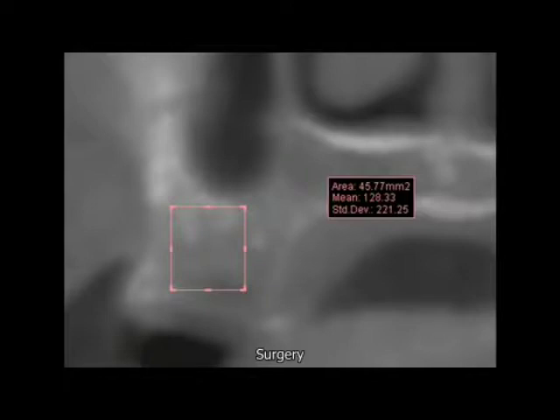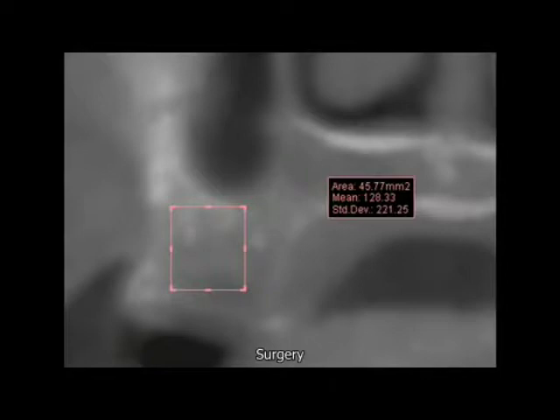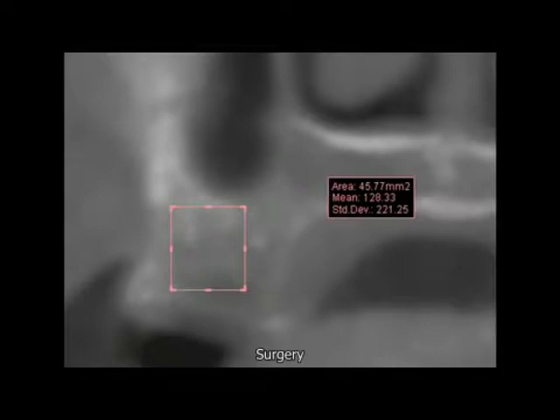What we will be doing for this patient is placing an implant 5.3mm in diameter and 10mm in height. However, before doing so, we will form the osteotomy using a combination of drills and osteotomes to condense the bone laterally, so the implant will engage better quality bone when inserted. We will also perform sinus lifting through the osteotomy side — two specialized techniques required to successfully place the implant in this particular location.